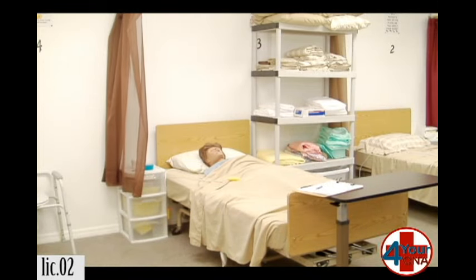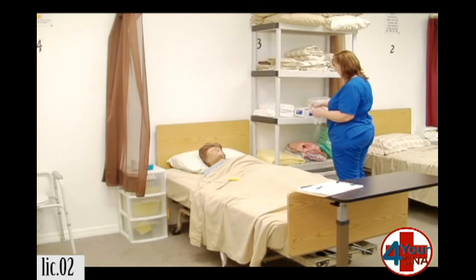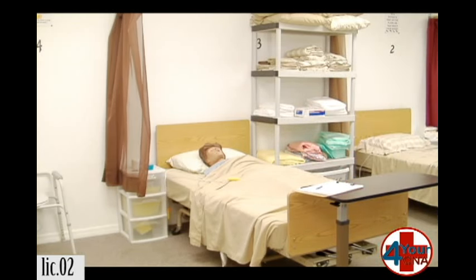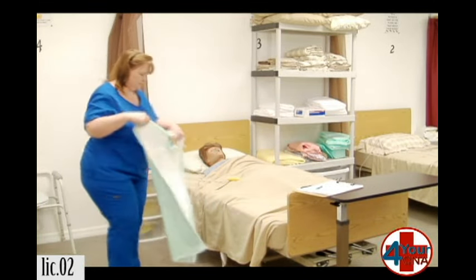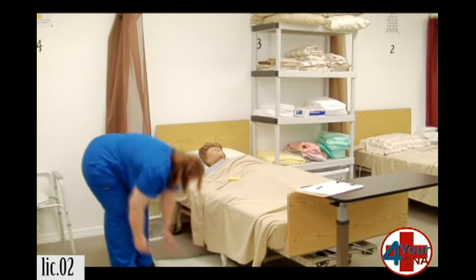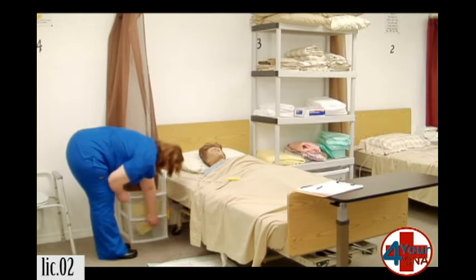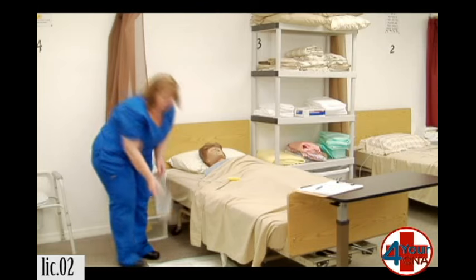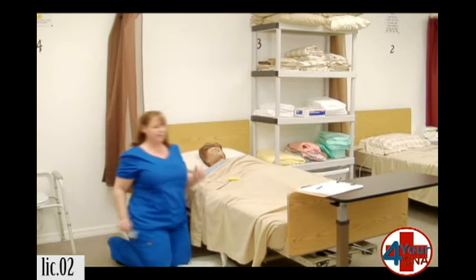I need a barrier to put down and a set of gloves. I'm going to get an alcohol pad and a urine measuring container. First thing I'm going to do is open my alcohol pad.